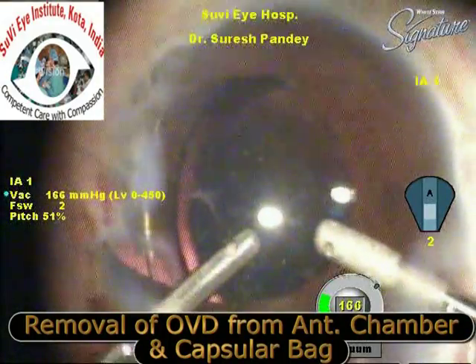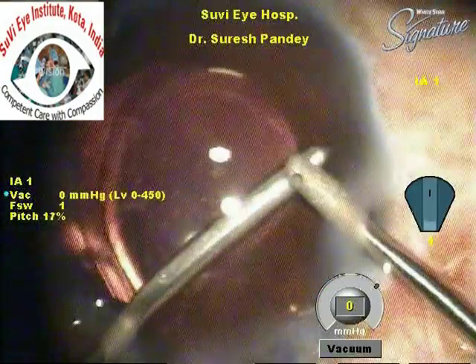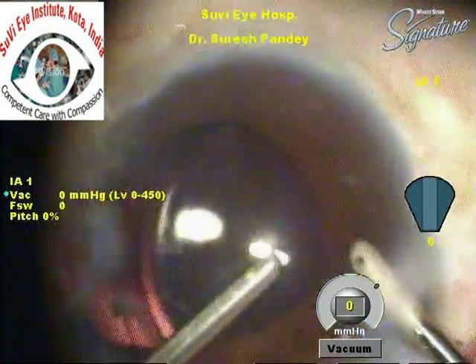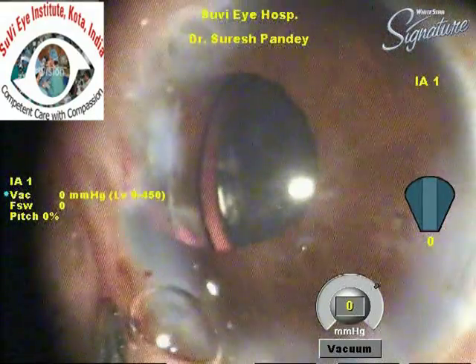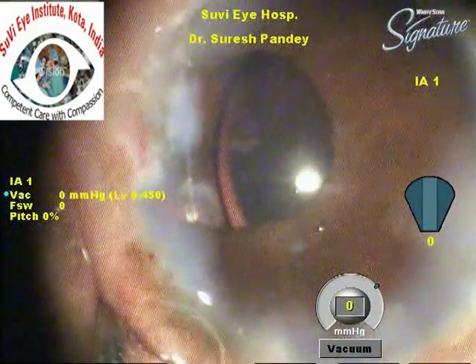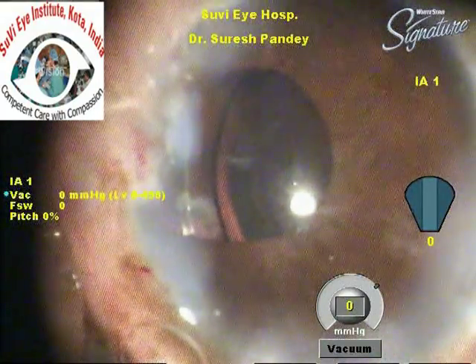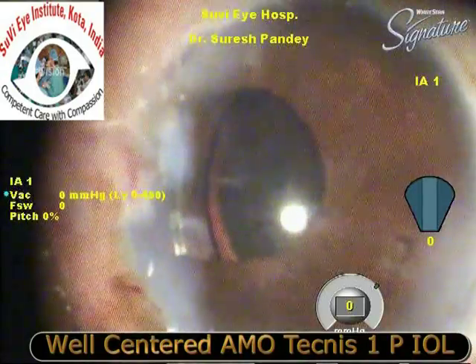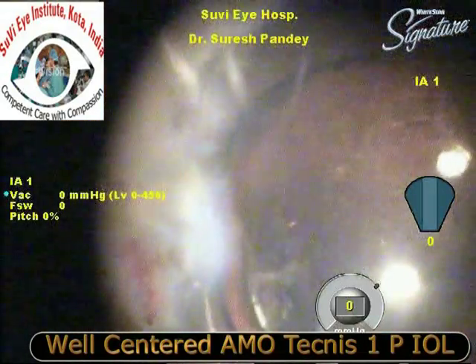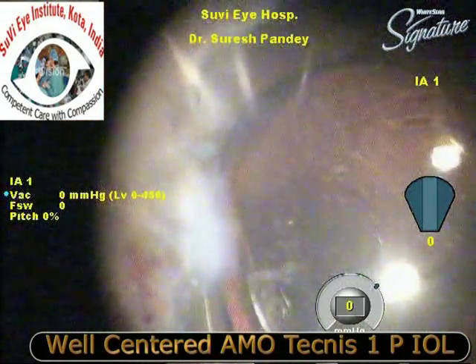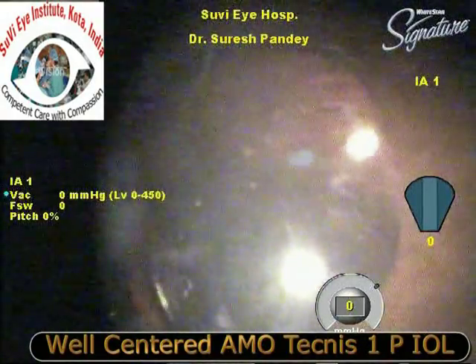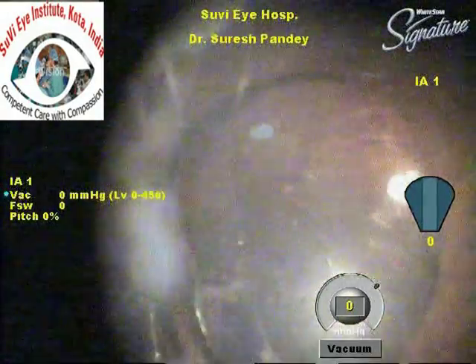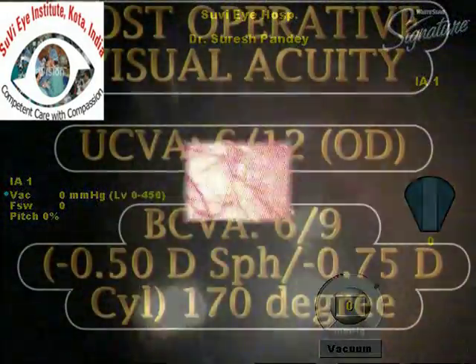We then remove viscoelastic from the anterior chamber and from the capsular bag. At the end of surgery, the IOL is well centered, though the pupil is slightly distorted due to the previous trauma. In the post-operative clip, the AMO IOL is very well centered.